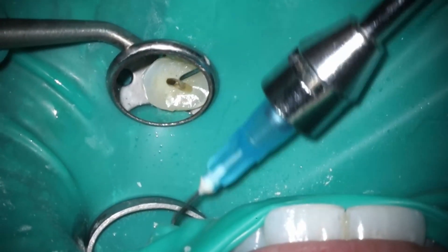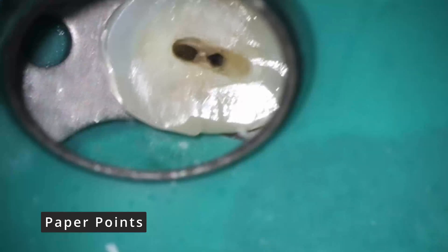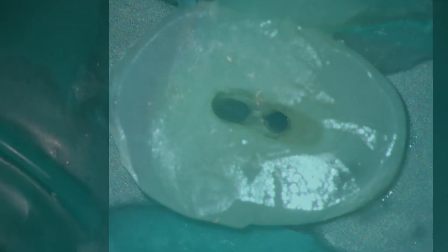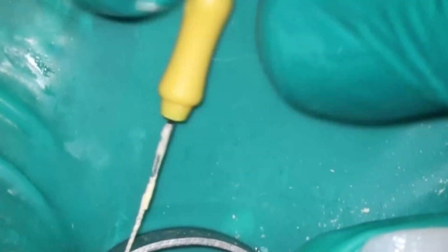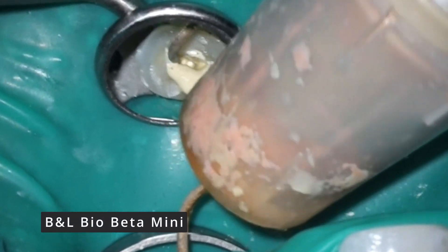As far as the fill on this, we're going to use the squirt technique. I have no qualms about taking it around a curve — that's exactly what this technique is designed for. I'd rather use the squirt technique in a case like this than use a cone, because as long as I have a nice clear glide path with the 20K file, the gutta-percha is going to flow. If I were to use a cone, it could easily get bound up along the way. There have been a few questions about photography — it's important to have high-quality images to send to the referring dentist to show the work you're doing as a specialist.